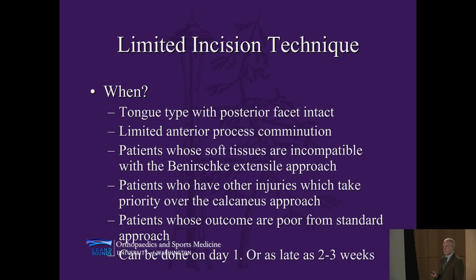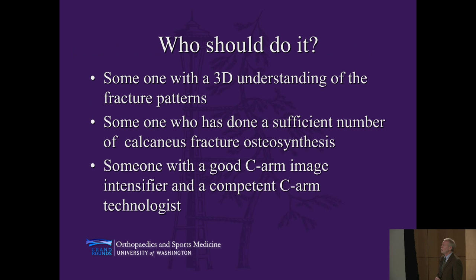So who should do it? The same people who do open treatment of calcaneus fractures. It is not that simple to do. You have to understand the fracture patterns, so you need a good 3D understanding of them. You need someone who has a C-arm and knows how to get into position. And you have to have done a sufficient number of calcaneus fractures by the open technique to really understand what the parts are. So how is it done?